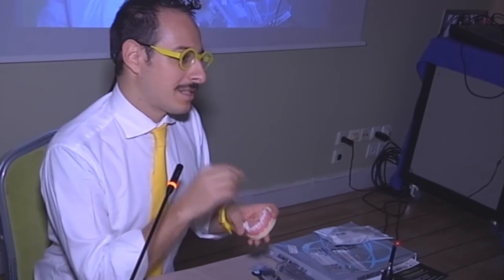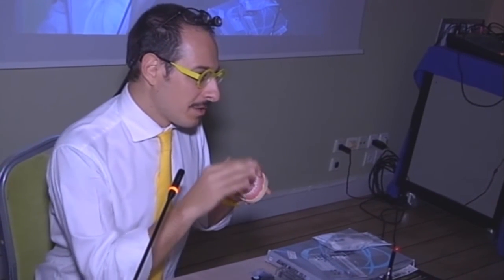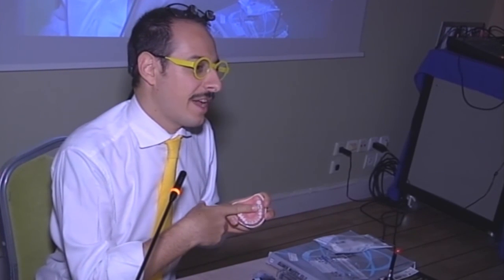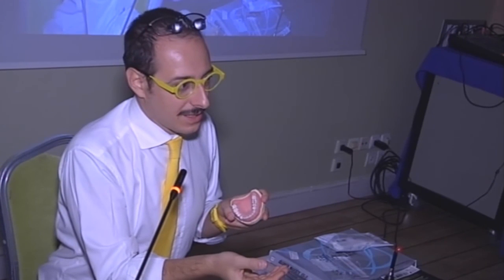You have to do it in posterior and above all in anterior, because if you do not do that, you start finishing and polishing, but you are not polishing cured composite. You are polishing uncured composite, and so you will not have this kind of glossy surface you can have with the OxyGuard use.